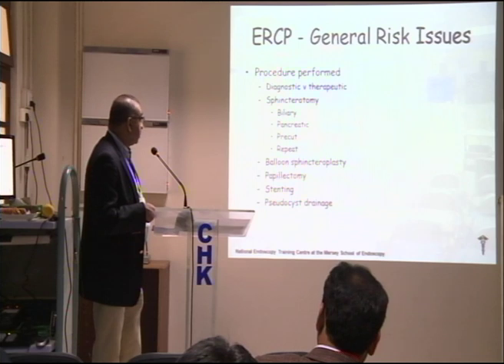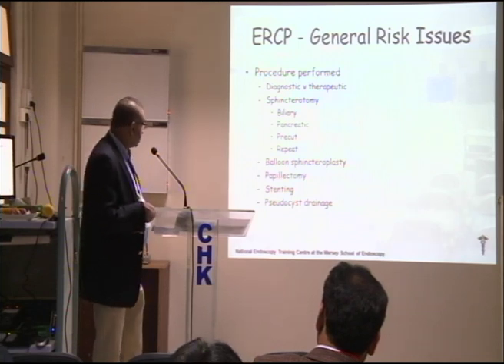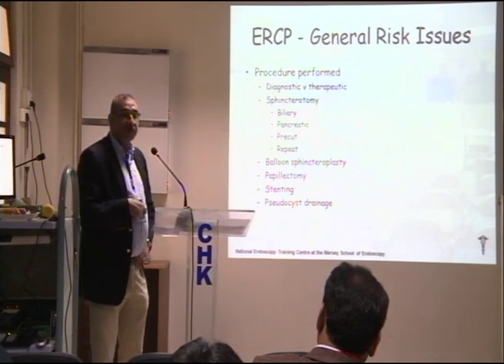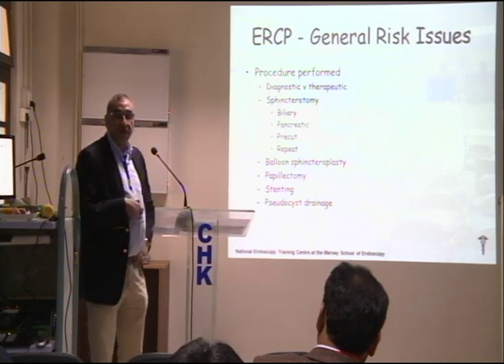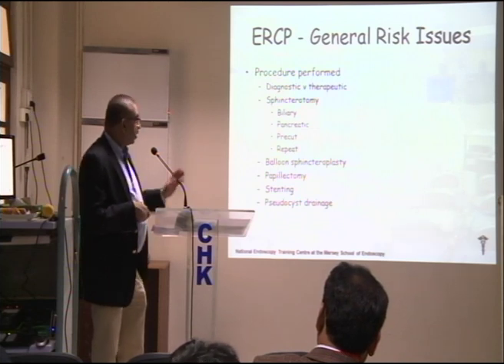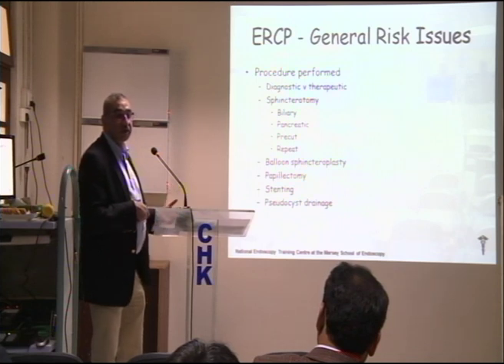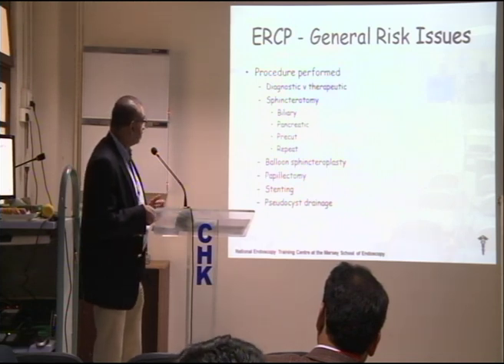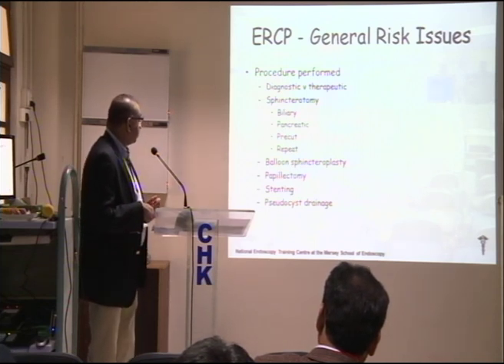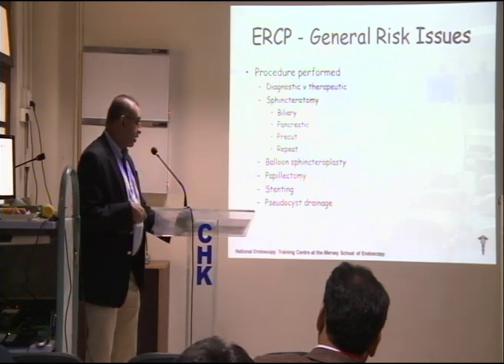Balloon sphincteroplasty is always high risk and should not be done by the inexperienced because there's high risk of causing bleeding, disruption to the duct, and pancreatitis. So you should not do it. Normally, we recommend a small sphincterotomy before the balloon sphincteroplasty, just like an episiotomy in labor. Papillectomy, stenting, pseudocyst drainage are all advanced procedures and should not be considered by this group at least.